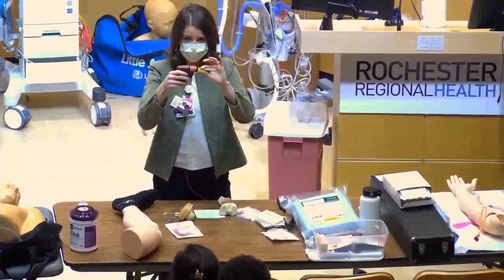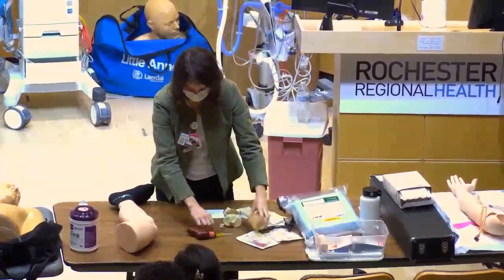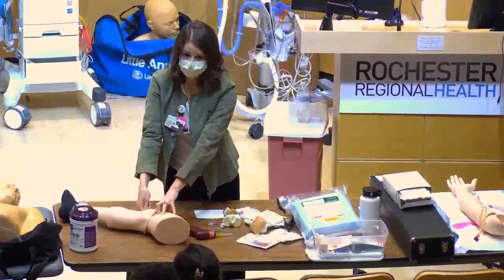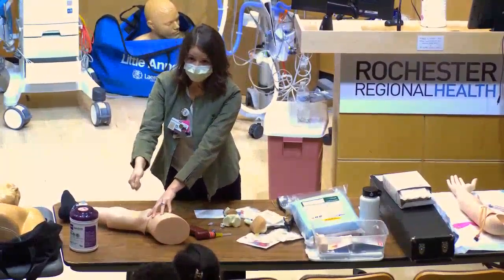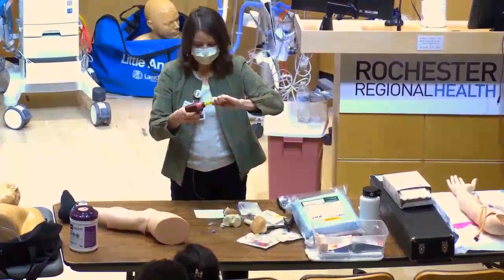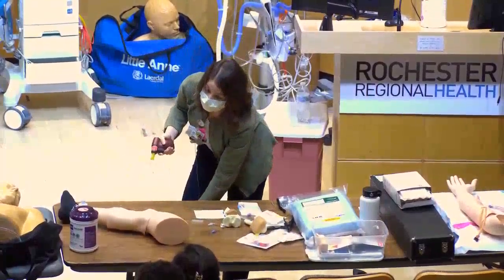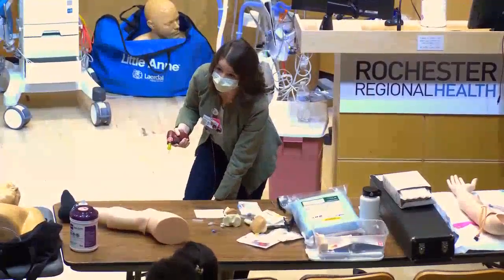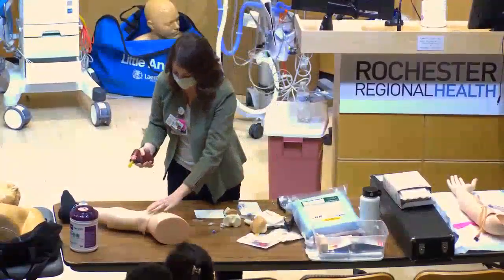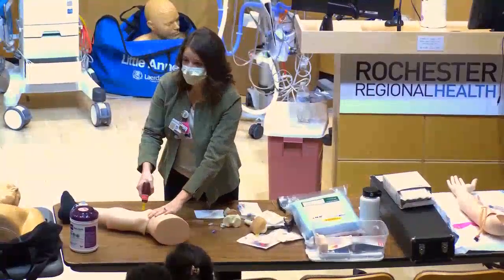Locate your landmark. For the tibial site, I usually stand on the opposite side of the bed and lean over — go in at a 90-degree angle, which is why it's easier to be on the opposite side so you can put your weight behind the drill. Clean the area and remove the cap. Find the flat, wider plateau of the shin. Go in at 90 degrees directly over the flat part, push through the skin, stop when you hit bone, then drill.